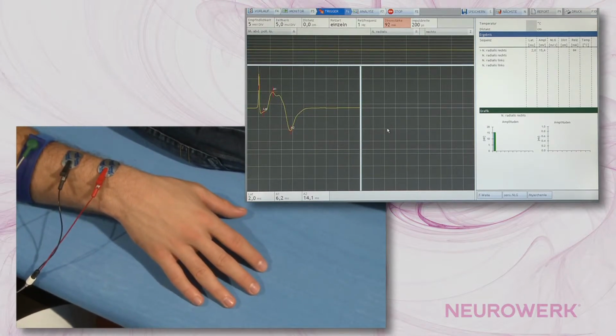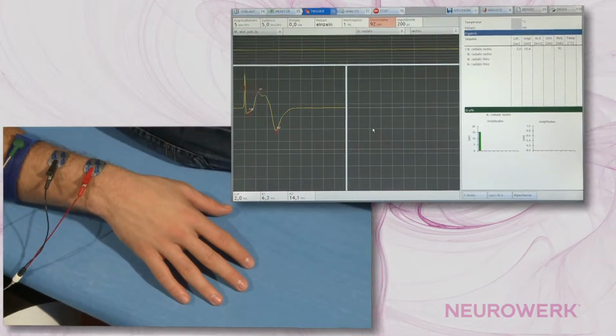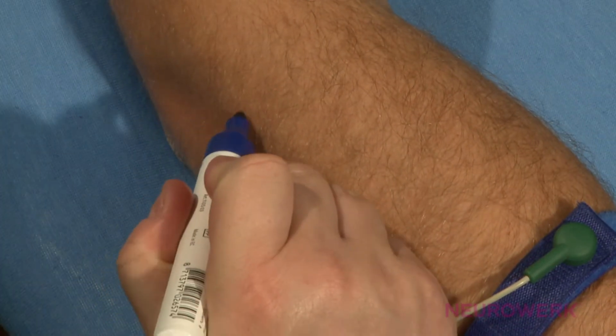After a supramaximal stimulated potential is recorded, you must not forget to mark the stimulation point.